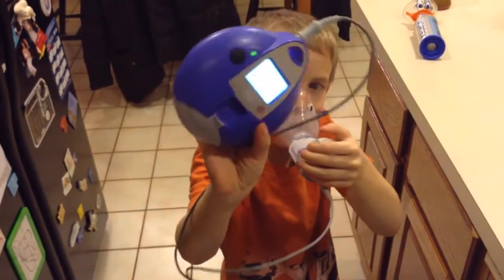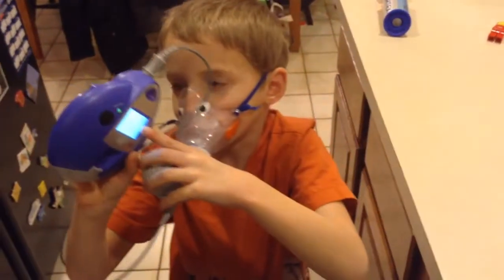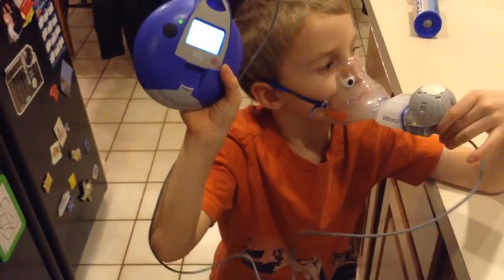You guys see this? It tells you when it's done or not. See this? This actually tells you. It's not bad.